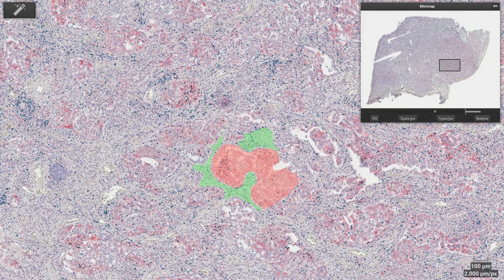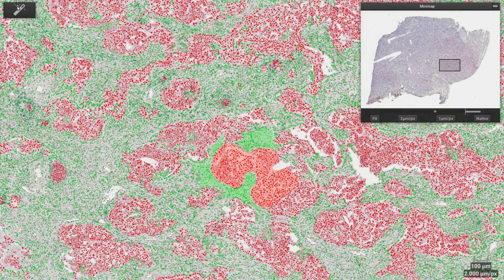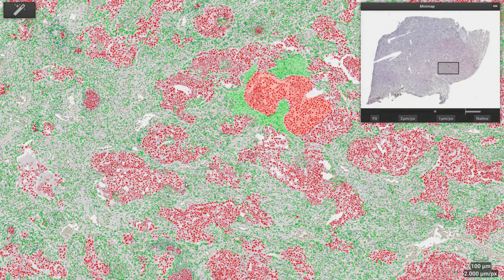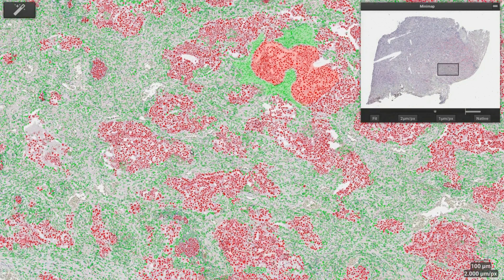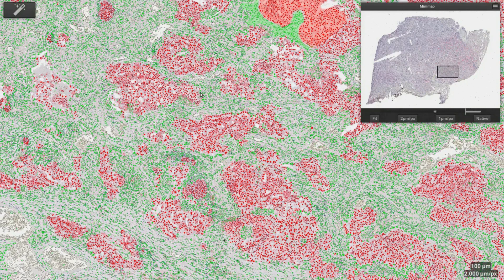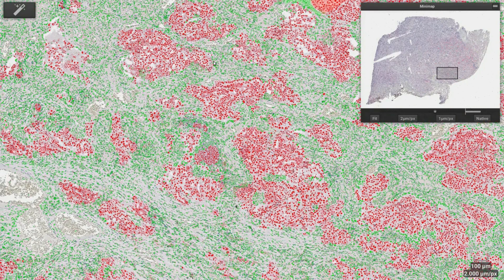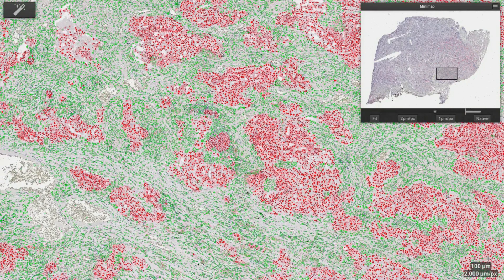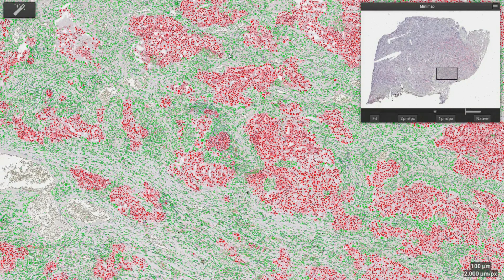The system provides the results quickly, in the order of seconds. The system displays all detected cells — here over 1 million cells for the whole slide — with different colors for the different tissue types. Here we display tumor cells in red and the cells in the tumor microenvironment in green.